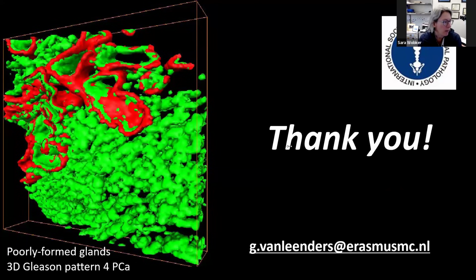One more question before we stop. In light of the recent ISUP GUPS consultation paper, how would you report an atypical intraductal proliferation that is not suspicious for IDC, but displays architecture or cytology beyond that typically seen in PIN? For example, micropapillary to focally loose cribriform.